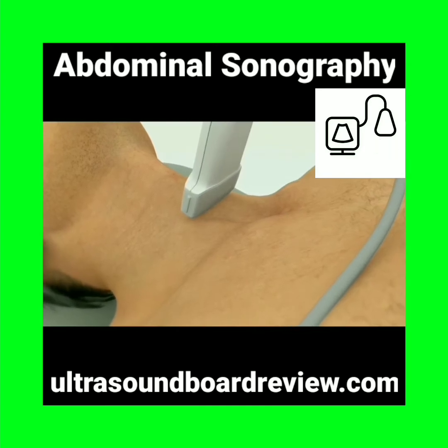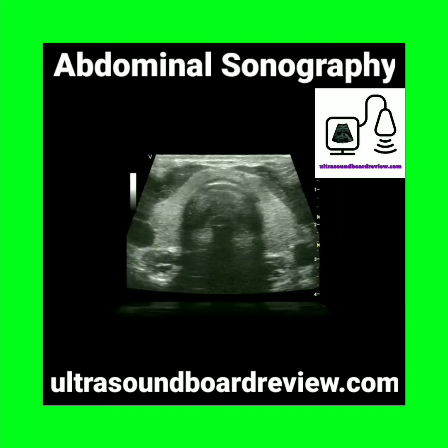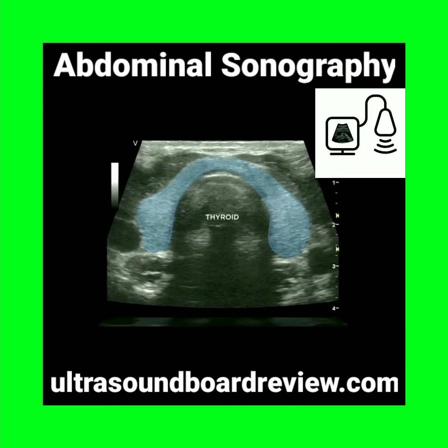To obtain a transverse view of the thyroid, make sure that the probe marker is facing toward the patient's right. Place the probe on the anterior surface of the neck between the larynx and the suprasternal notch. Adjust the position of the probe so that the thyroid is in the center of the screen. Note the homogeneous echo texture of the normal thyroid gland.